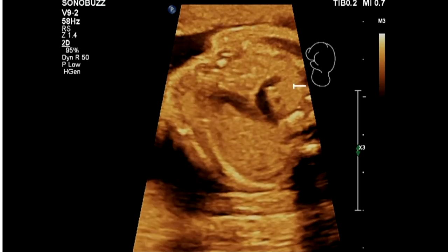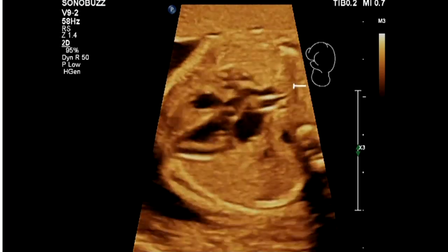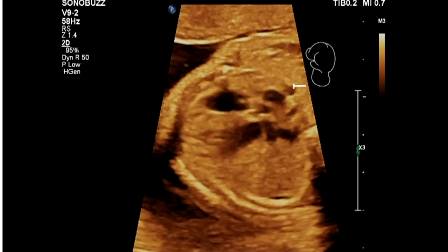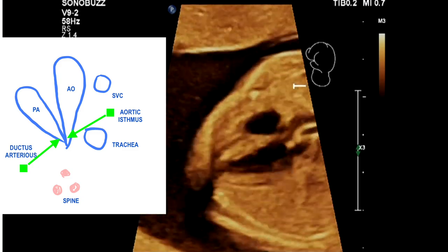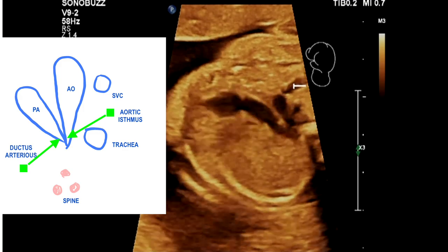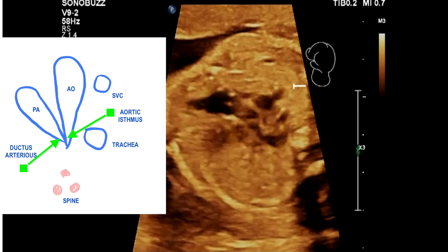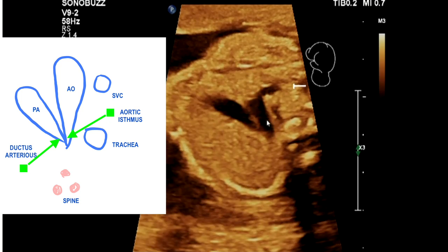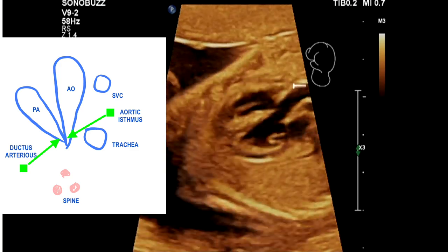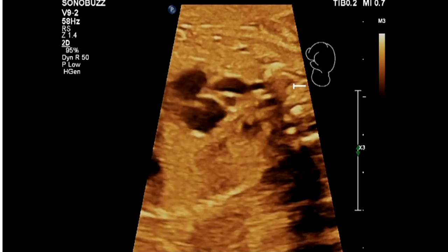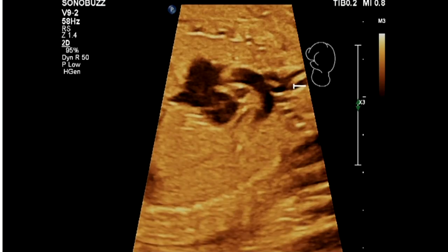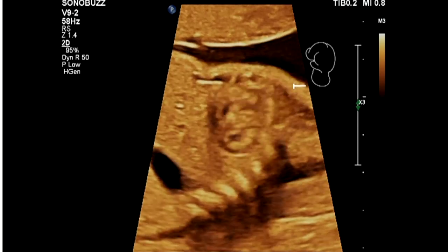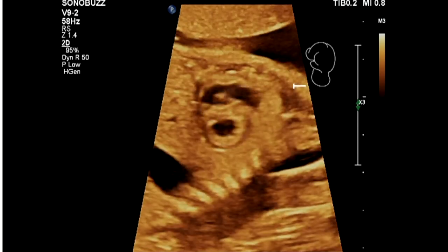Here's the pulmonary valve and PA. This is the sweep I was talking about earlier — watch the aorta go up, come down into the three-vessel view, then watch the PA come down and make the V. This is the one sweep I think is important: from four-chamber to LVOT to RVOT and then the V. You can see the aorta comes down to the left of the trachea. We can also look sagittally — just turn a little bit to get sagittal imaging. There's the aortic arch with the head and neck vessels.